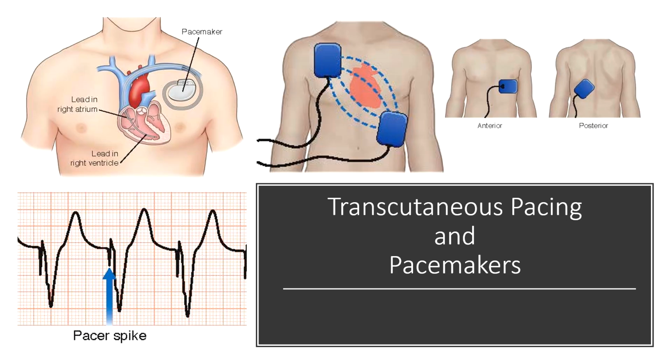And then just a couple other things. Transcutaneous pacing or pacemakers can pace heart rates that are low, like patients that are symptomatic bradycardic. So just look at where they would put the patches or the paddles to pace your patient. They can also have an implanted pacemaker for patients that are at risk for sudden cardiac death, patients that have heart failure and low ejection fraction. They can implant that pacemaker. People that are aging can have a pacemaker if their SA node isn't working. And then it should give us a pacer spike, which is shown in the bottom picture graph, if it's working correctly.